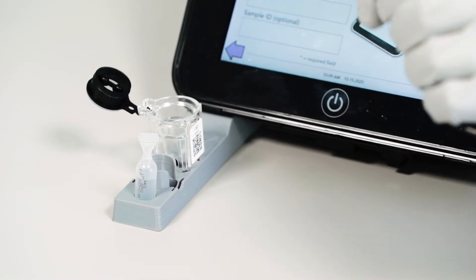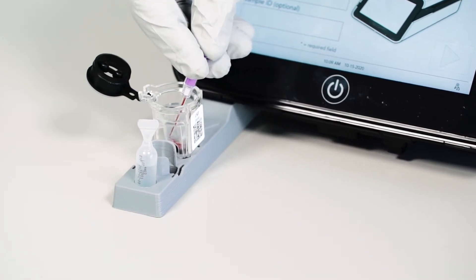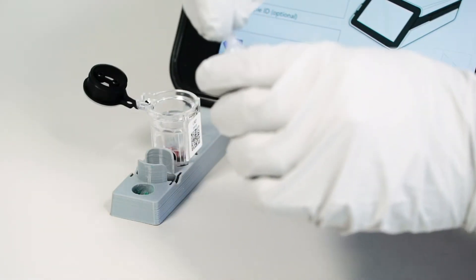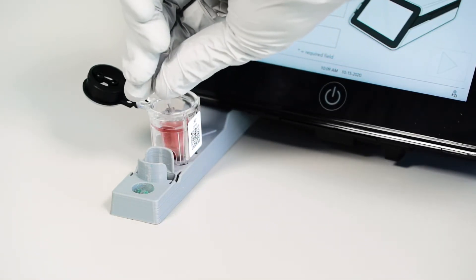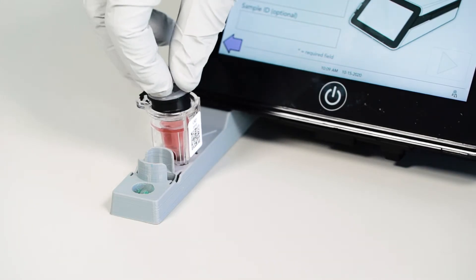Dispense the blood sample into the cartridge by placing your finger over the end of the plunger and pressing it inward. Discard after dispensing. Open the buffer bulb by gripping and rotating the tab at the tip. Dispense the entire contents of the bulb into the reaction cartridge. Close the cartridge firmly and completely.